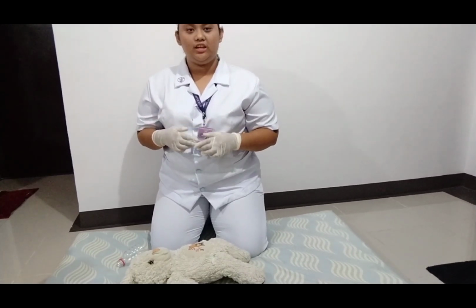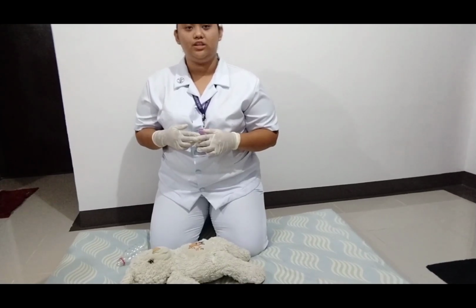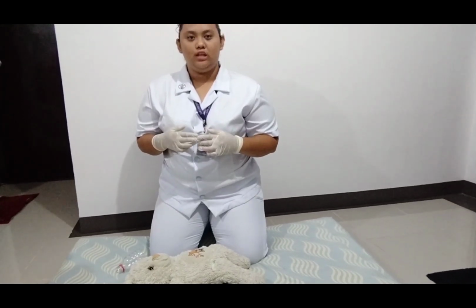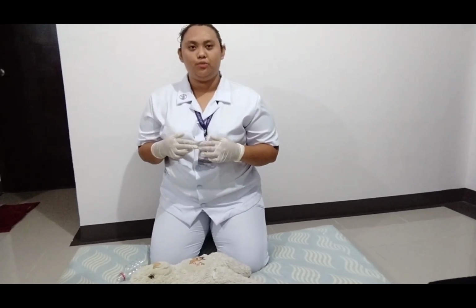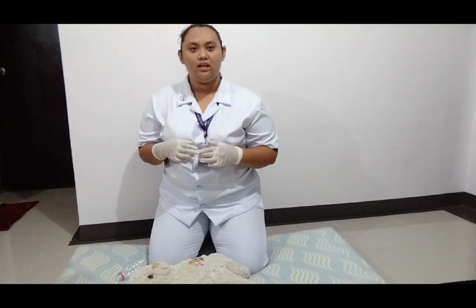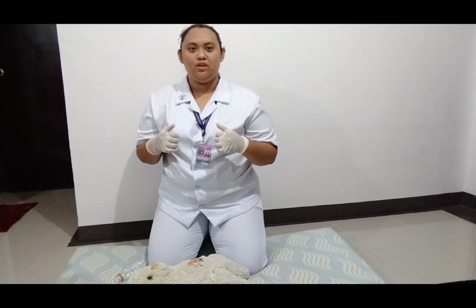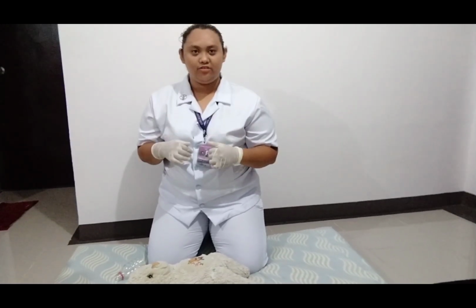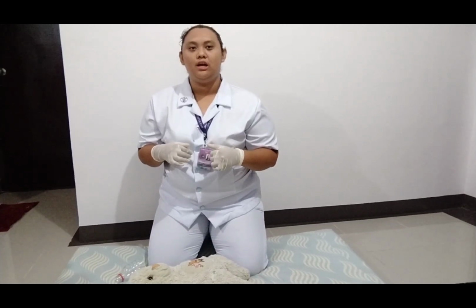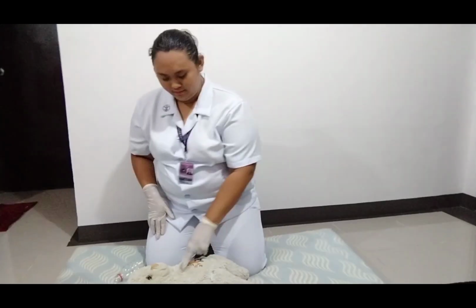So my patient here is an infant. Infants are within the age range of 1 month to 1 year old. And so in order to deliver the chest compression, we'll have to use 2 or 3 fingers, or we could also do the thumb technique like this. We encircle the baby's body using our hands, and then let our thumb rest on the chest area of the patient and then start the compression. But I'm going to use the 2 finger or 3 fingers method.